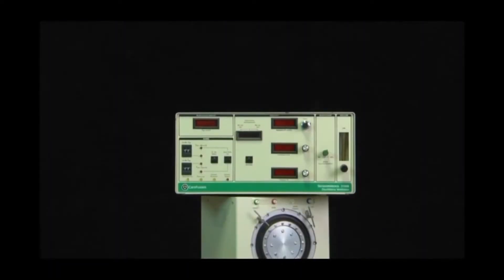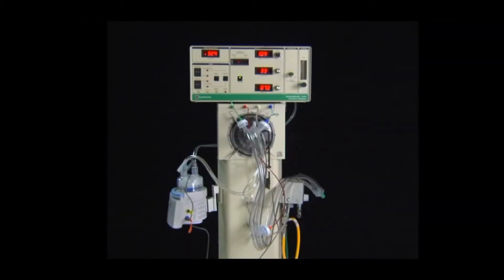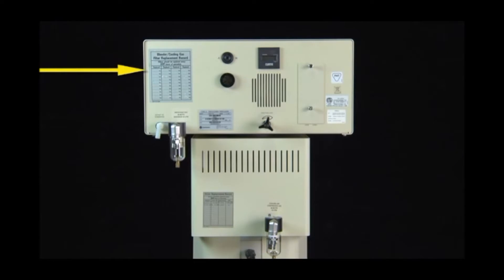The 3100B is comprised of two parts, the head and the ventilator body. On the back panel, the blender cooling gas filter replacement record and the driver replacement record are provided to assist service personnel in the proper maintenance of the ventilator.